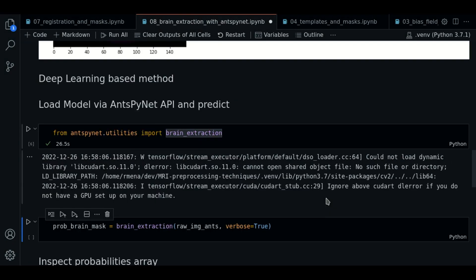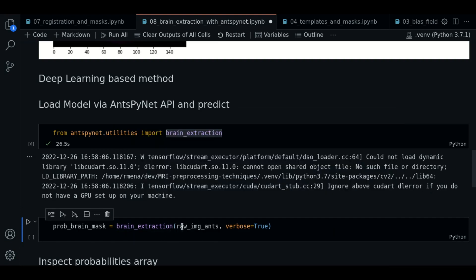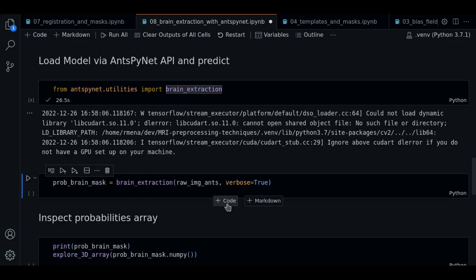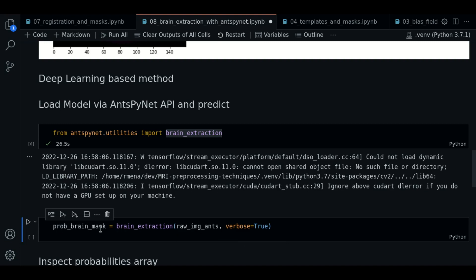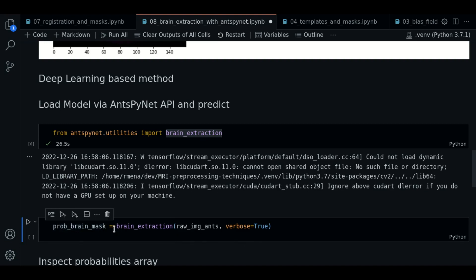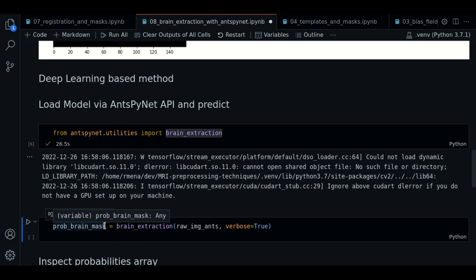By now, ignore these warnings. The function to do brain extraction is pretty simple. We call the brain extraction, we pass the ANTS image, and this will return a probability image. Each value inside contains the probability of the pixel to be part of the brain. We will later process this to get the brain mask.